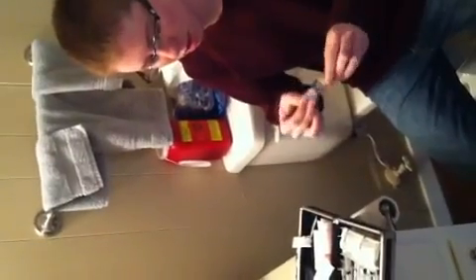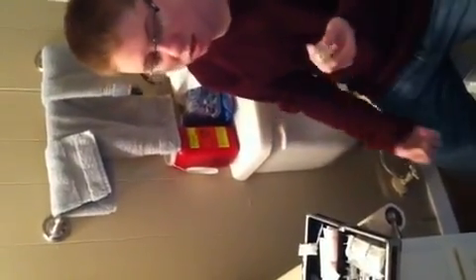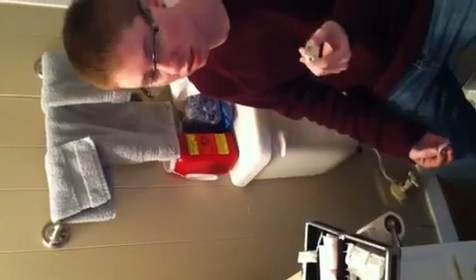So you have your T, you get it out. This is the first thing you do, because it takes the longest. So while you're preparing everything, you want this to be drying. You get your T out, and then you want to get an alcohol swab, and you're going to wipe down the top of your T. The reason why is because you want to sterilize the area, because you don't want to be pushing germs into the bottle. Okay, so you're going to set that aside and let that dry while you're doing everything else.